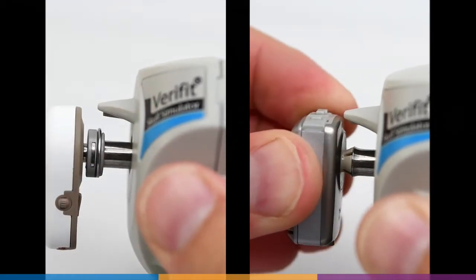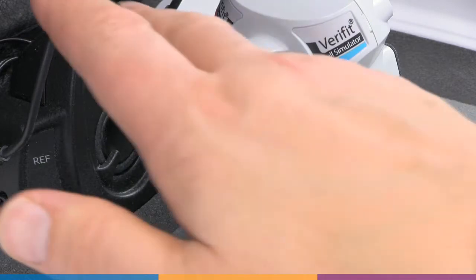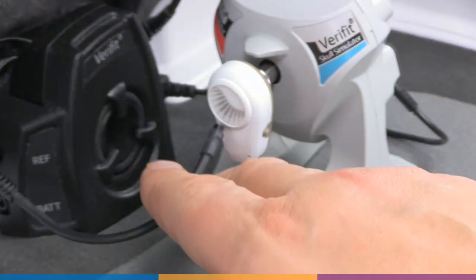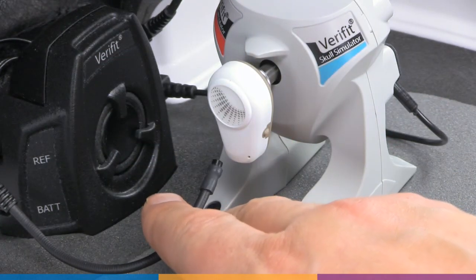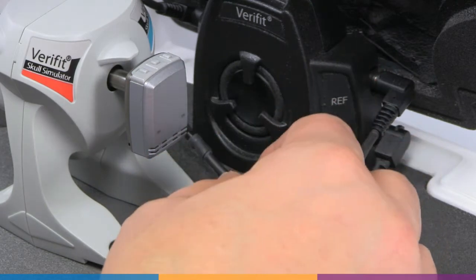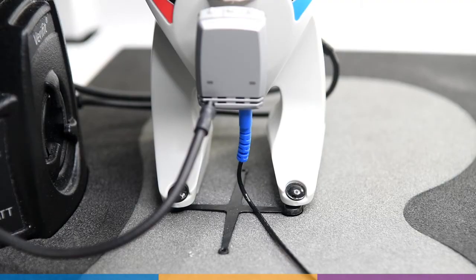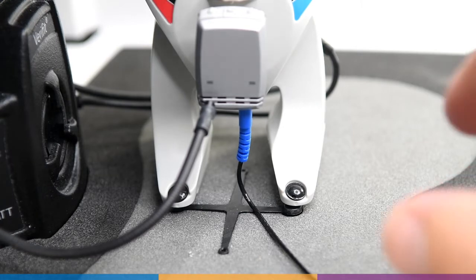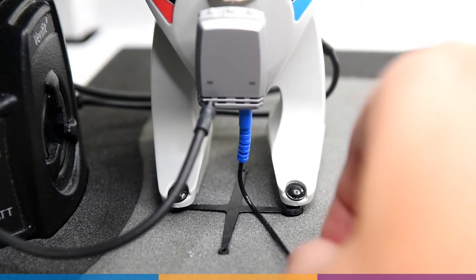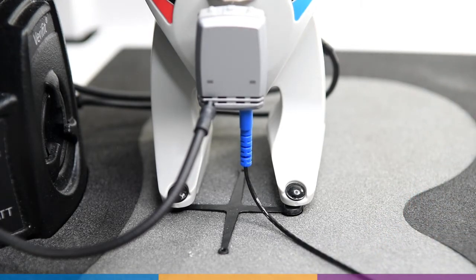Attach the BAHD Ponto or Baja style device to the artificial abutment on the Skull Simulator using the typical manufacturer-recommended approach. For left devices, position the left reference microphone 1 to 3 millimeters from the front microphone opening. For right devices, do the same with the right reference microphone. If a programming cable is attached, ensure that it drapes loosely away from the unit and does not push against the test box floor, as tension in the programming cable can cause feedback in the device.